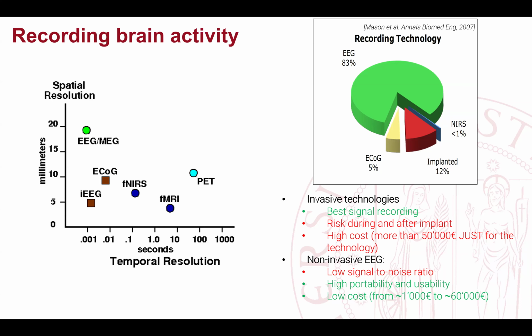Okay. But it's not decoding the yes, no. It's decoding just 1 and 0. But they can associate it then to right and left or to up and down. That depends again on the application. Maybe it's enough. So do we really need more? I mean, all our computers work with 1 and 0. So can we not just work with that? Since with EEG we can record 1 and 0, can we use only that for our application?